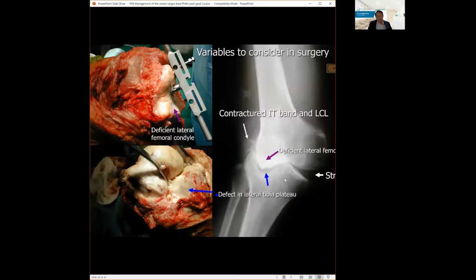You can see here the distal resection guide going into the IM canal, and often the severely hypoplastic lateral femoral condyle does not even come in contact with the resection guide, or the resection just barely skims across the hardened eburnated surface of the lateral femoral condyle.